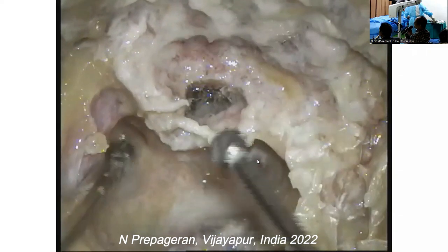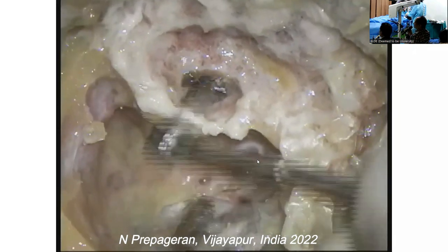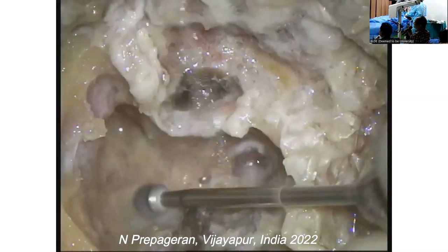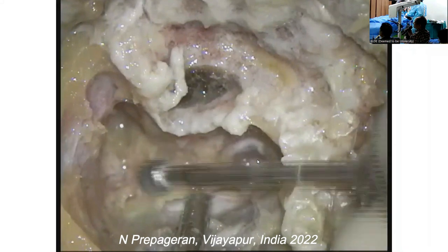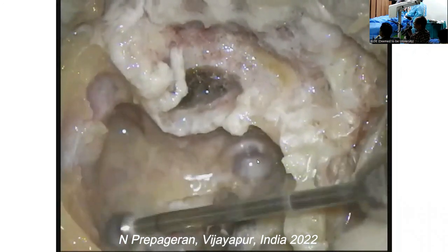And for the beginners, you can see the slant of the dura here. This is not a flat line. It's a sclerotic mastoid, a difficult mastoid, and the dura is slanting like this. This has to be kept in mind. As it approaches here, it comes down. There is a slant which we must keep in mind. Otherwise, we'll drill like this.